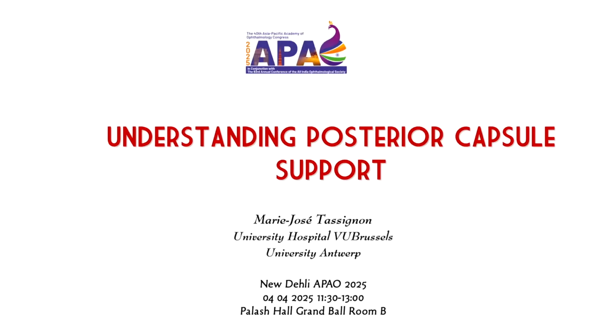Thank you very much. So now I will present a most challenging video on new insights about retrolenticular space.